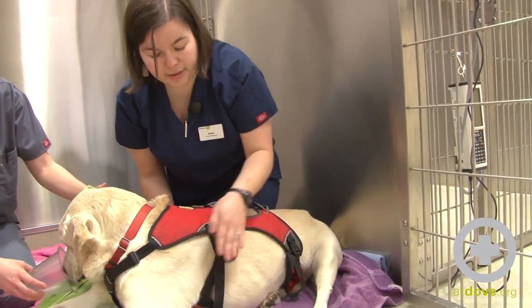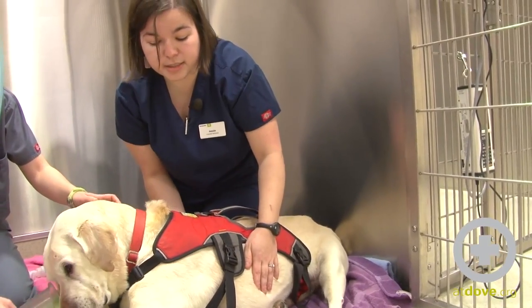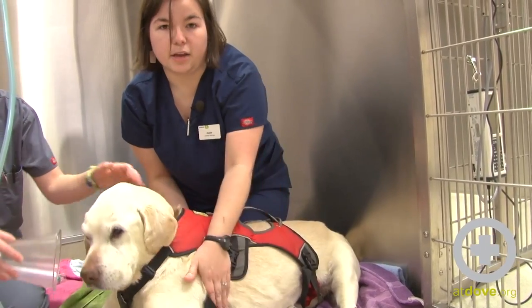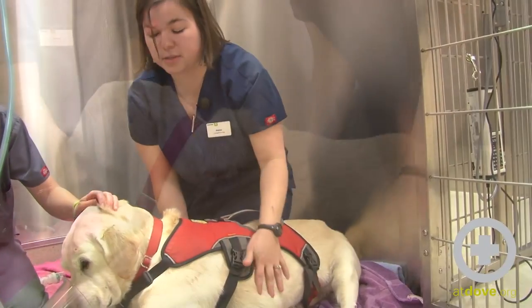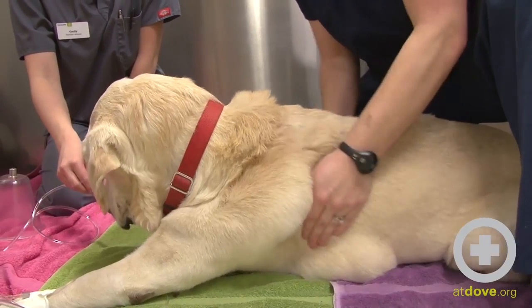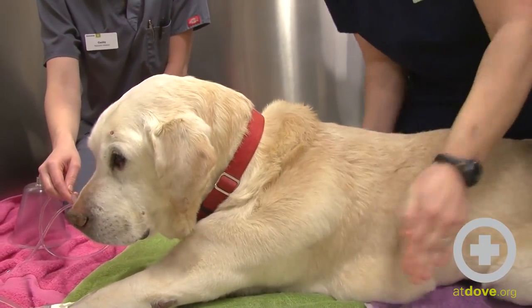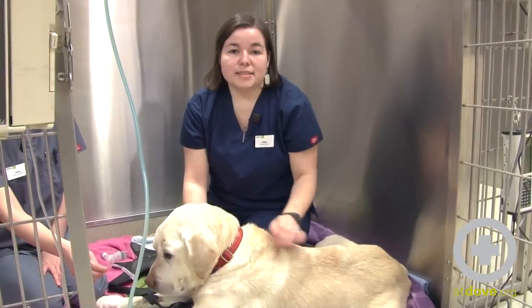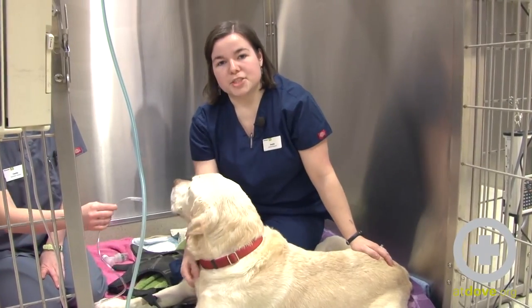I usually try to get the whole of their chest, and I will try to do forward motions with it — start from the back and go forward to try and help him expel it out. So that's how we do nebulization and coupage here at Dove Lewis.